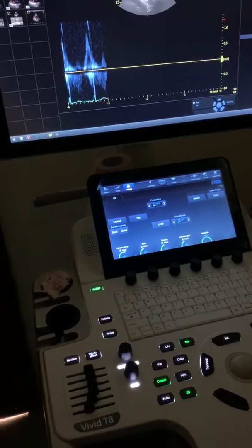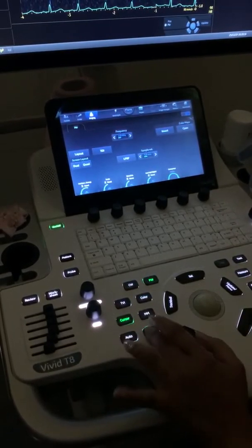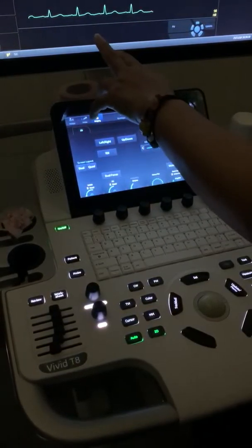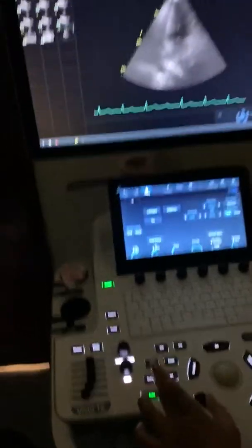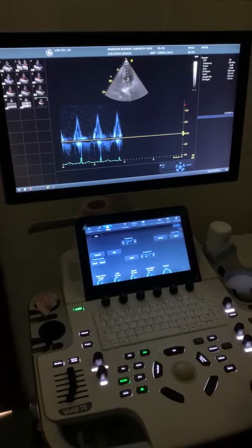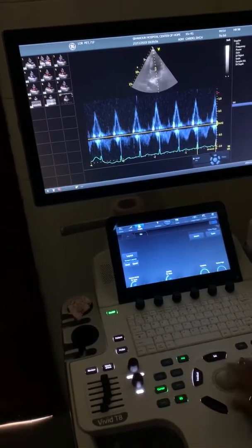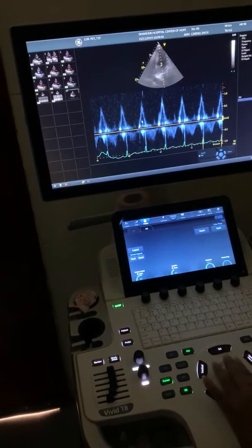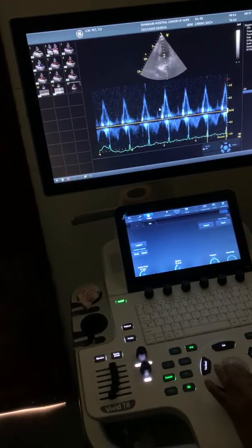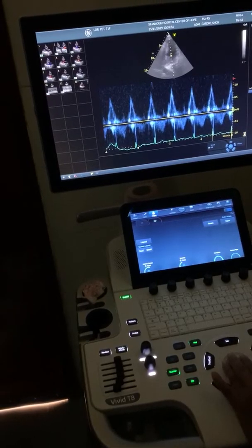Okay, in mitral valve - her case is sinus rhythm, but she's kind of a maybe taken valve. We can do mitral E/A, but because her heart rate is 98, I think it's fused already. See, this is what's happened to your diastole - they're fused because her heart rate is 98.